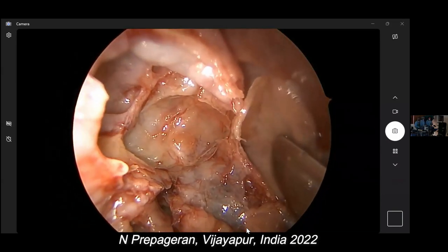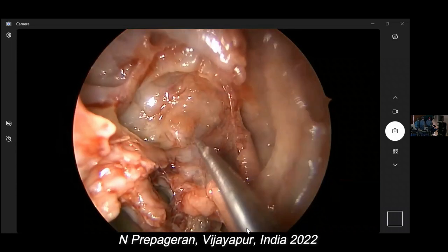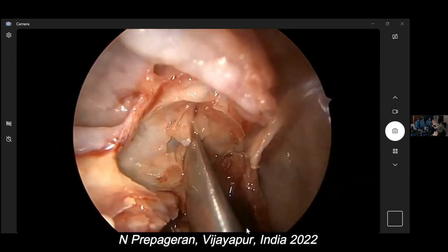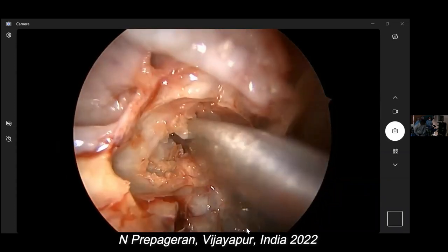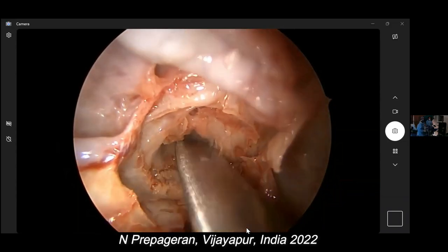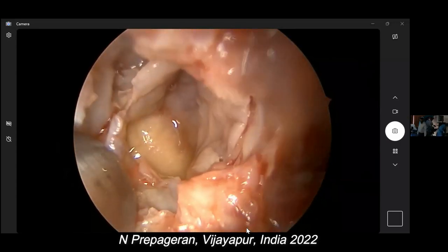So now you have the vertical aspect of ground lamella. This is where the ground lamella turns medially. That's the vertical aspect, horizontal aspect. Where do you go? The junction of the vertical and horizontal aspect, go in between and you enter posterior ethmoid. Can you see, guys? Anterior ethmoids will be with multiple air cells. Posterior ethmoids will be few air cells, but large air cells.